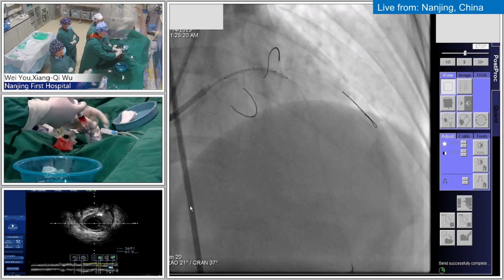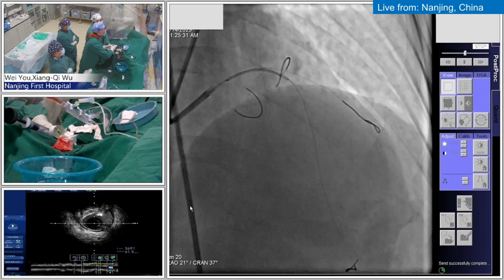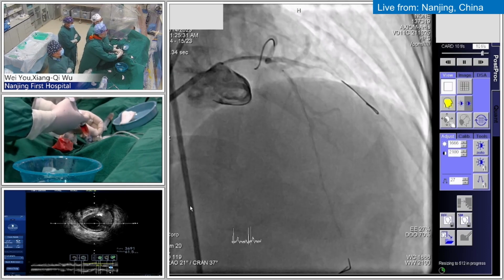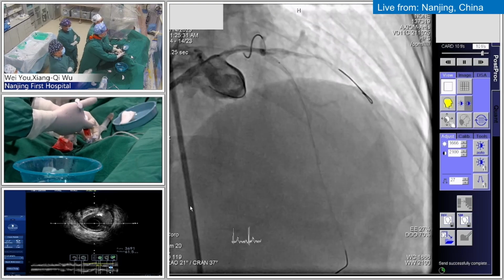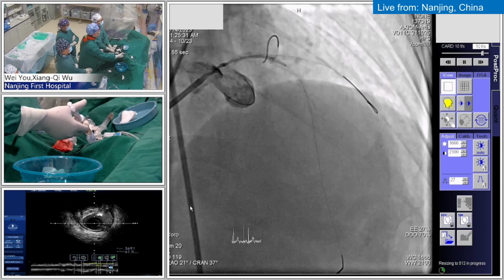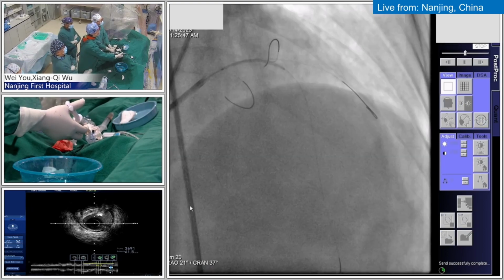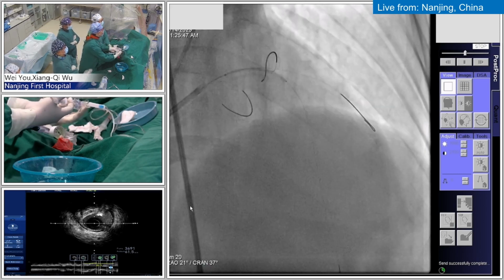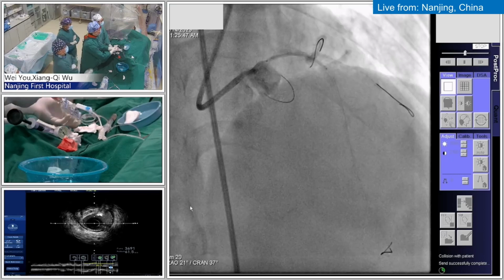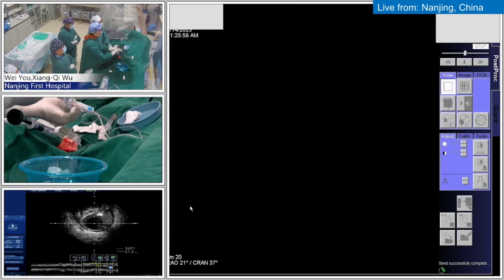Thank you. So are you happy with this? Take a picture. Okay. Yeah, right. Picture. How do you think? Maybe a little more distal, a millimeter or two, but it looks all right. It should cover very nicely. Okay, you want to insert a bit more? Yeah, a little bit more, I thought. Okay. But I think you're okay. You don't want to. Test please. Okay. Let's take one more puff. Okay. Yeah, looks all right. Okay. Picture again.